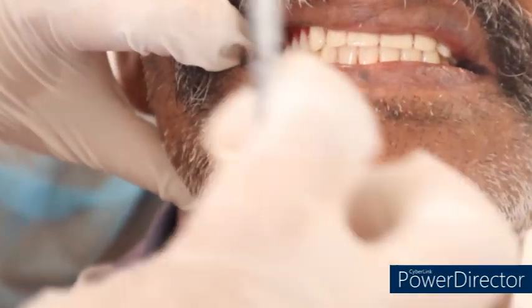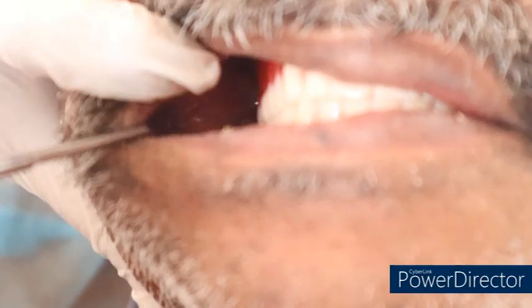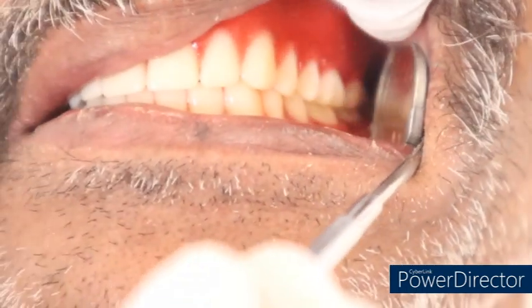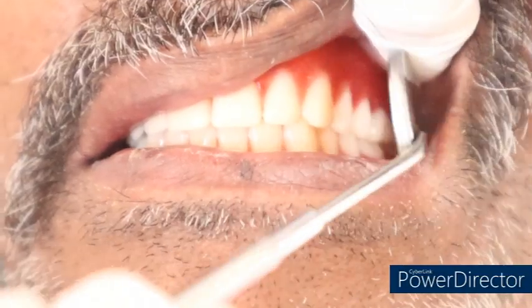Now after retracting with the mouth mirror, you have to see that all the posteriors are in simultaneous contact. Similarly, when you move the mouth mirror to the other side, you have to see that all the posterior teeth are in simultaneous contact. There should not be any gap between the teeth. In case there is any discrepancy or gap between the teeth, it means that the centric relation is wrong. You have to redo the centric relation or increase the teeth accordingly.